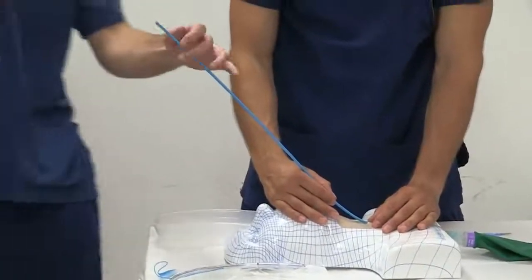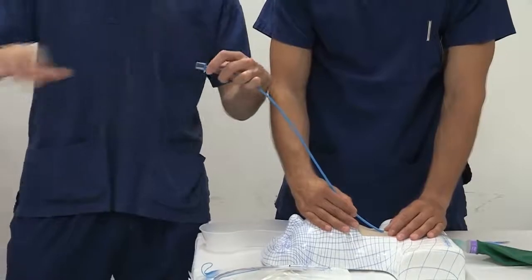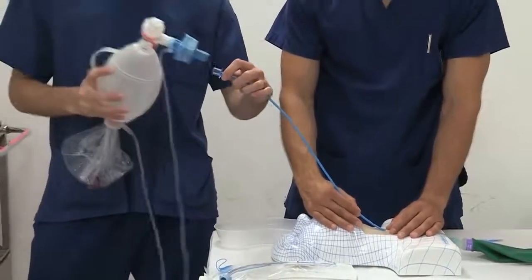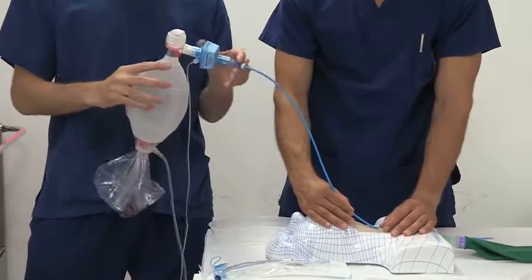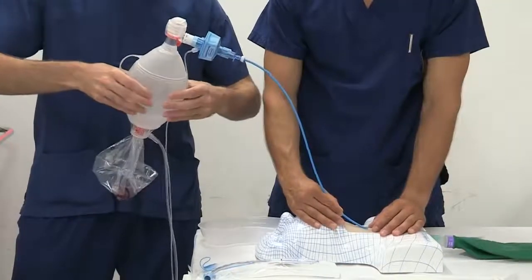A 15mm RapiFit connector must be attached to the Frova bougie to allow self-inflating bag oxygenation. This requires two operators: one to hold the bougie and one to bag.